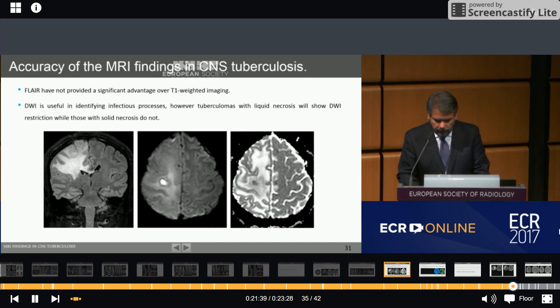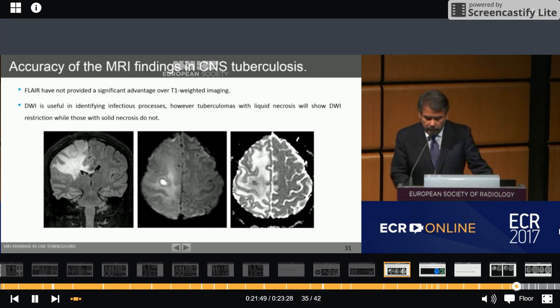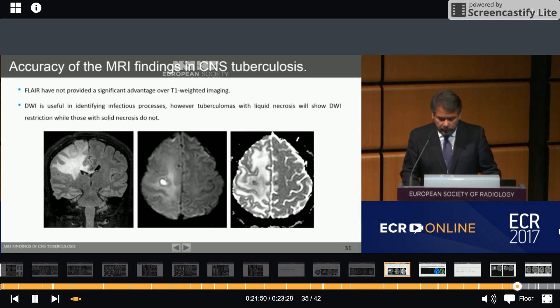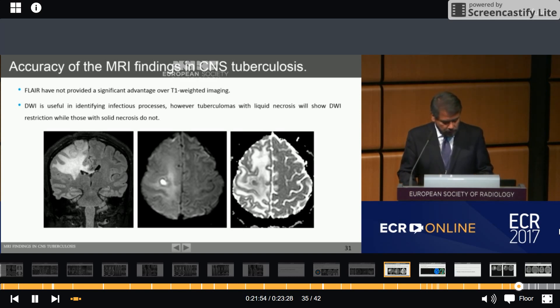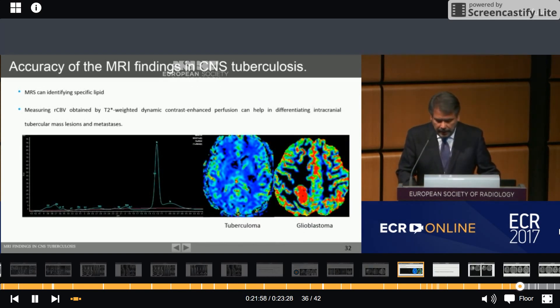Diffusion-weighted imaging is useful to identify the infection process. Tuberculomas with liquid necrosis will show diffusion restriction, while those with solid lesions do not. MRI spectroscopy can identify specific lipids.